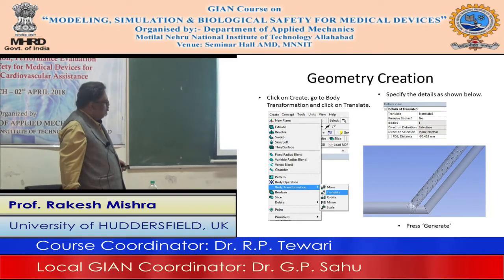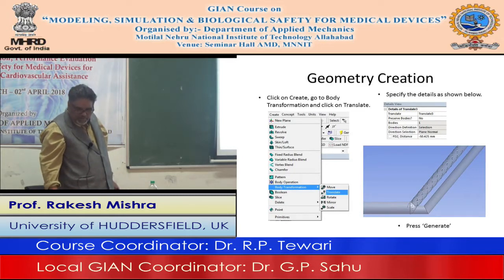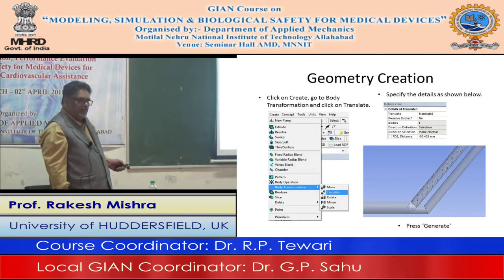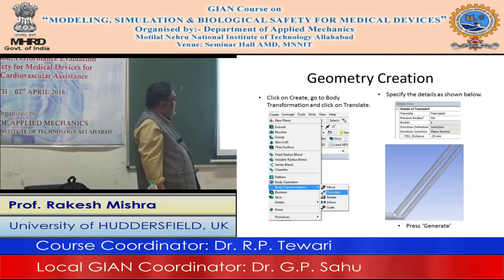Again, it is very close to the bifurcation. So I would like to place it properly at a particular point. So I can again translate it along this direction at a proper distance. So what we do again now is we translate it till it reaches the position I want. So first translation is at minus 50.425 millimeters, and the second translation is at minus 25 millimeters, and it reaches its position perfectly. Okay. So now the stent is part of the artery and it is located at a proper point.